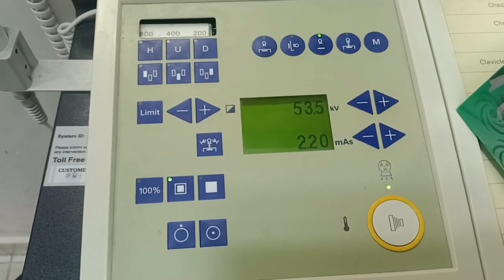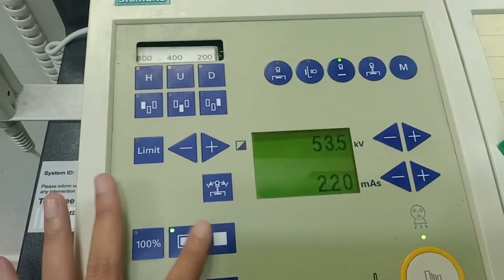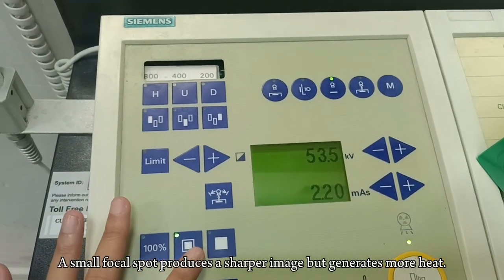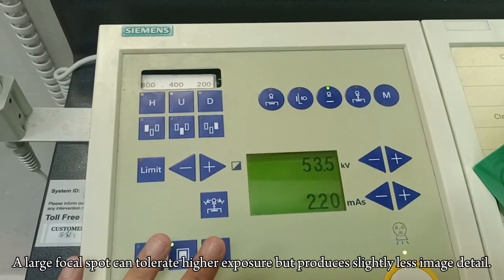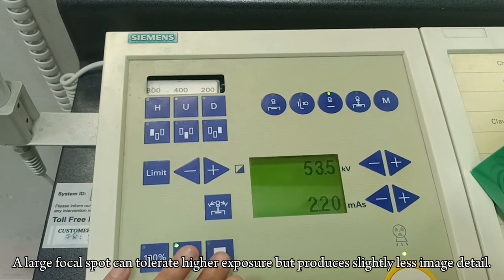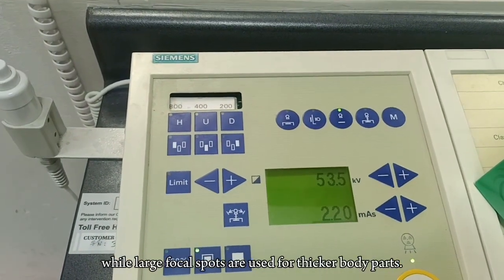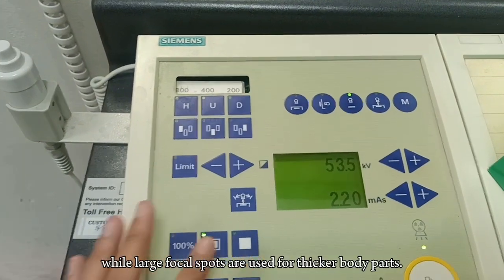Alright, for the next part, I will be talking about focal spot size. This is the focal spot. The area where electrons strike the anode is known as the focal spot. A small focal spot produces a sharper image but generates more heat. A large focal spot can tolerate higher exposure but produces slightly less image detail. This is why small spots are used for extremities while large focal spots are used for thicker body parts.